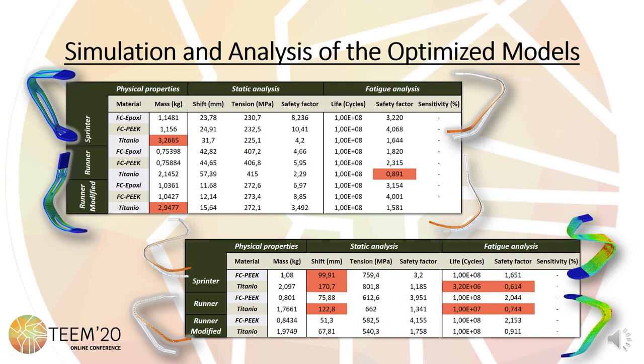The topologically optimized models follow a similar trend as the initial models. The runner models suffer much higher deformation compared to the other models, even exceeding the limit. The fatigue simulation accentuates this, leaving the maximum stress very close to the fatigue limit. Regarding mass, it has been possible to reduce the volume of all models making them lighter. However, the lattice structures suffer from very high stress levels and deformation in some models, and the fatigue simulation corroborates the poor design of the Sprinter and Runner models.